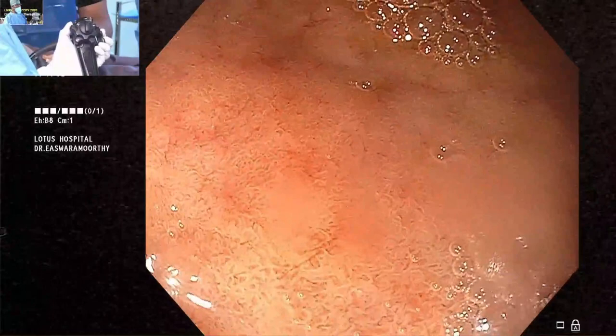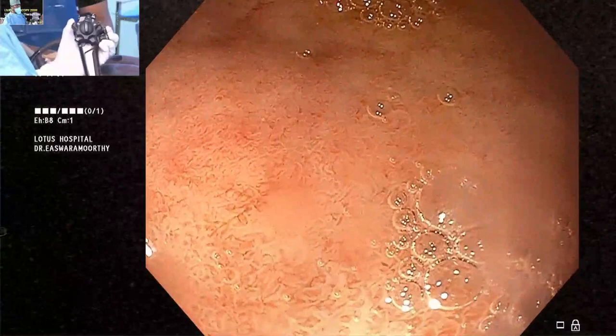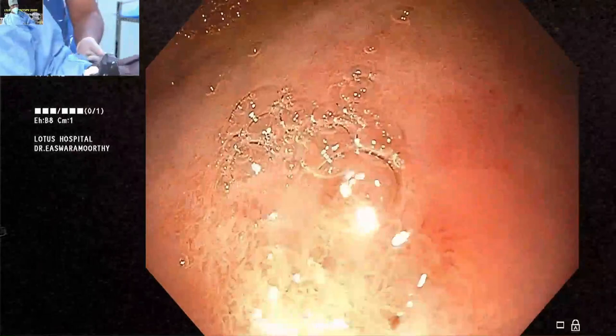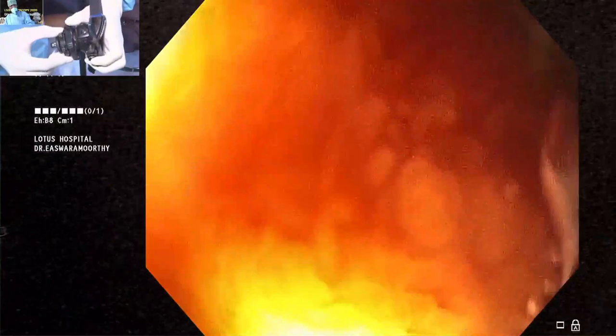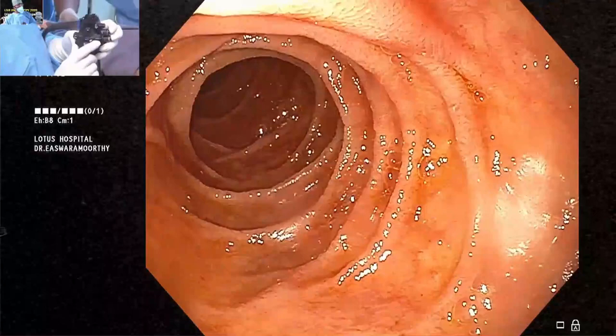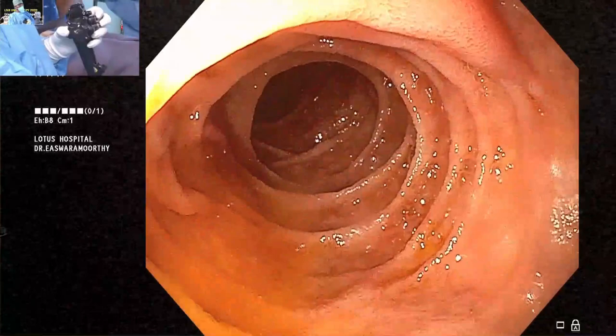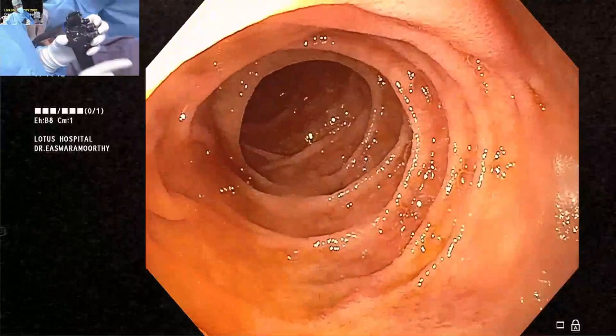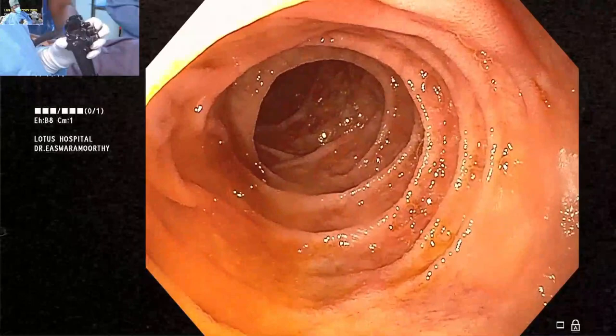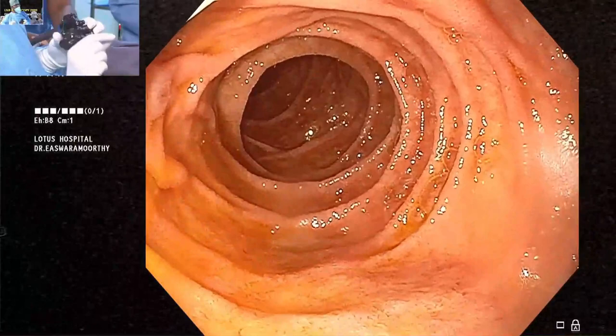In D1, what you see toward nine o'clock is the anterior wall. To see the posterior wall — which is important for surgeons — use body movement combined with turning the small wheel away from you. This allows you to progress into D2. The featureless view becomes horizontal folds with uneven contour. At the nine o'clock position on the medial wall is the ampulla — the only vertical fold there. With an end-viewing scope you cannot appreciate it as well as with a side-viewing scope, but reaching the ampulla is the endpoint of the examination.